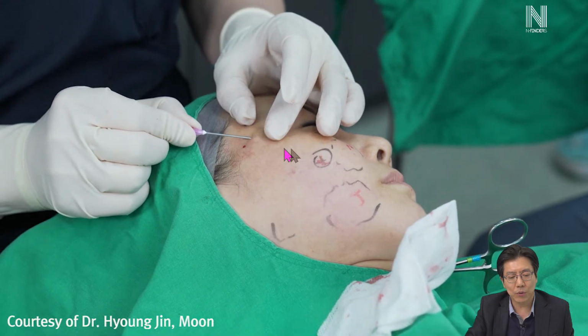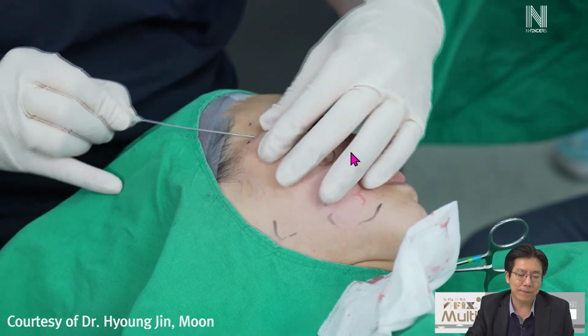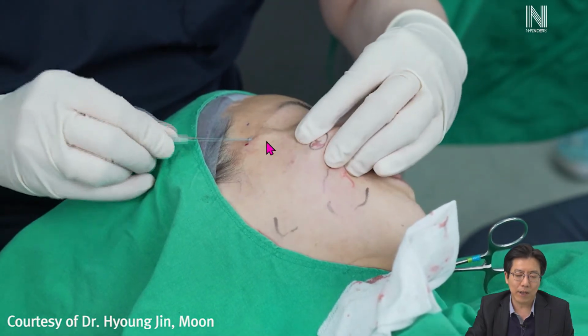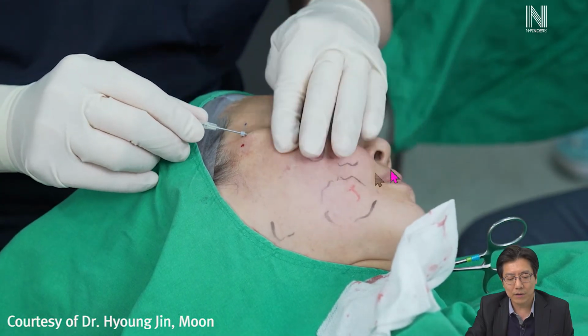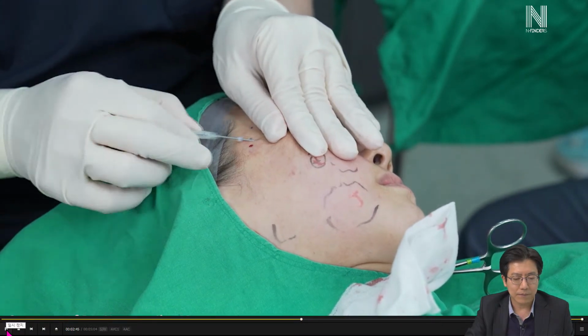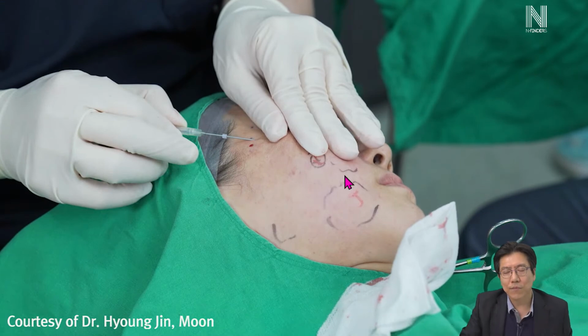And let's move to the nasal fat lifting. Make a hole in this triangle and put the thread to our target fat compartment. So this is the technique for the Asians.